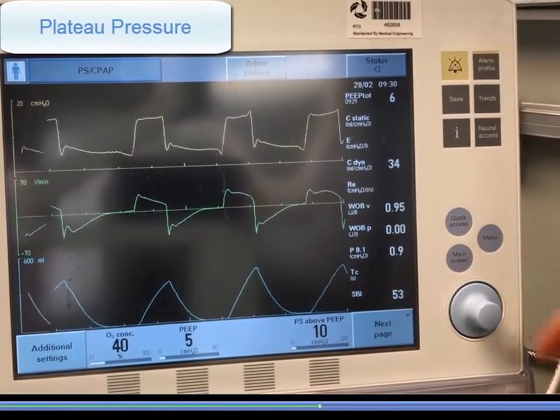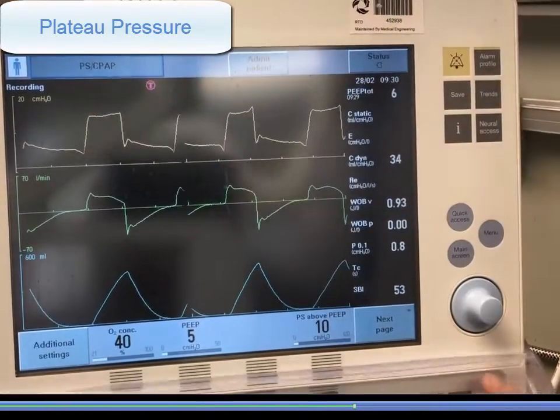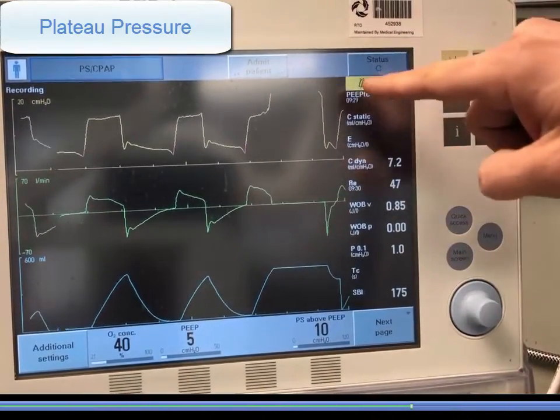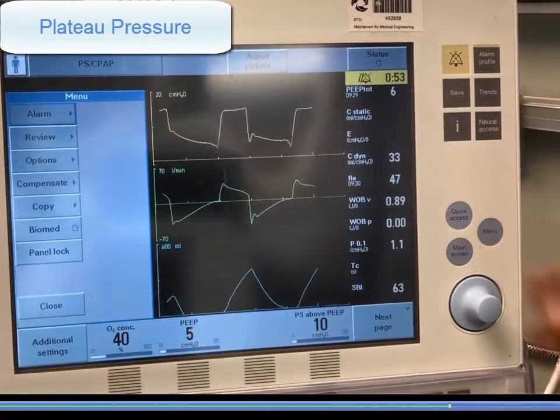To obtain a plateau pressure, press the save soft key and observe that the vent is recording as before. Perform an inspiratory hold for a single patient effort and wait a few seconds during the hold to ensure a reliable plateau. Wait for the recording to complete.